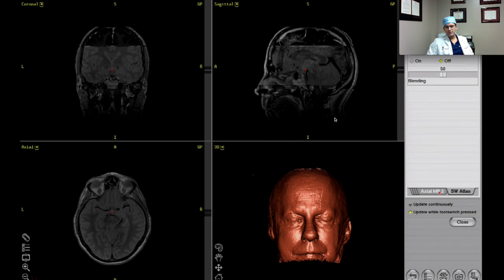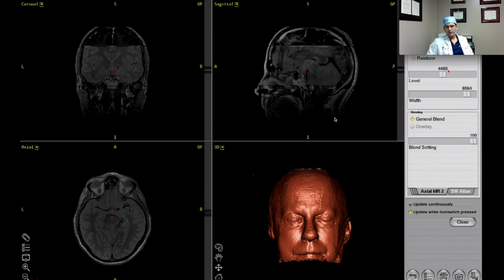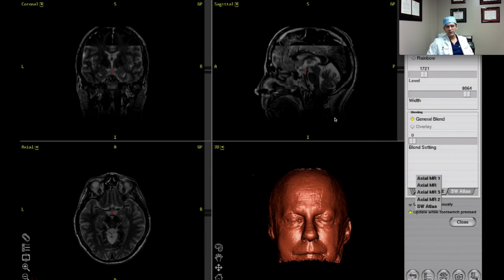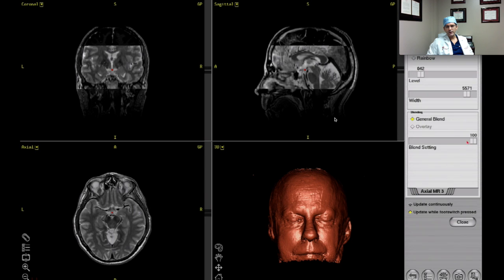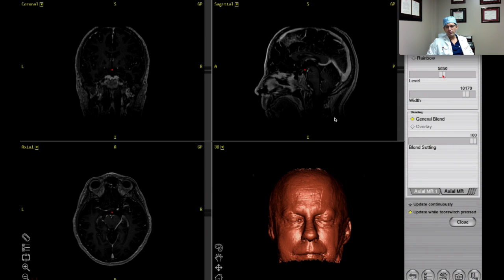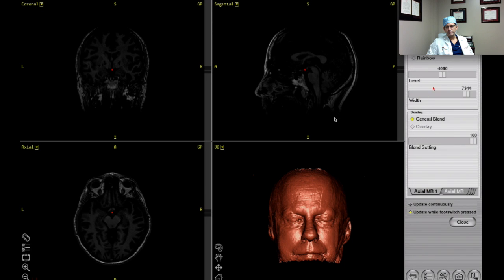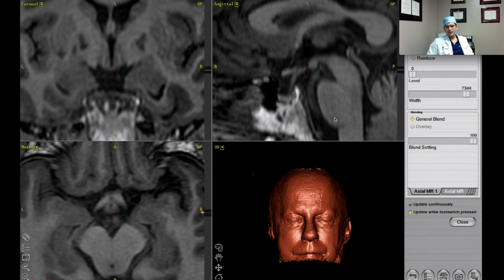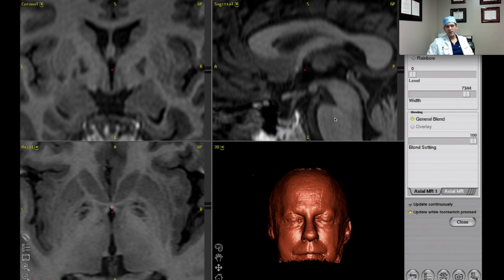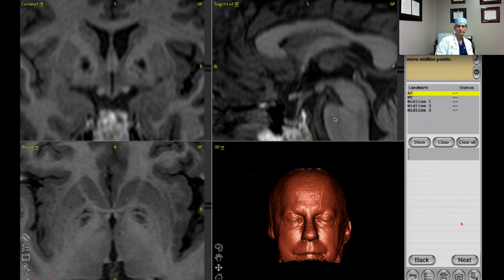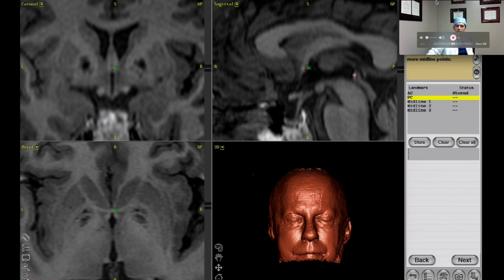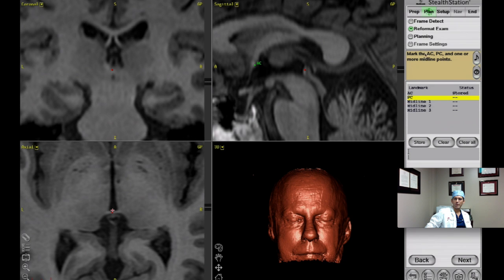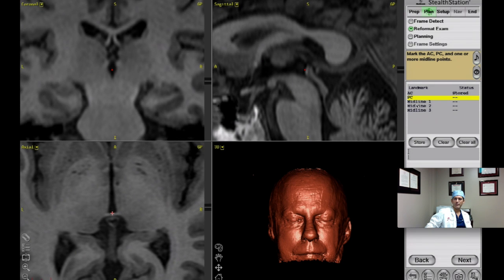During this time, the patient is basically going to sleep with anesthesia and we're placing the frame. This is a surgery done under general anesthesia. I'm windowing — I have four sequences up at this point, and usually the default is a little bit dark so I'm brightening it up. And there's the anterior commissure. I'll move this window so you can see what we're marking — the ACPC points and then three midline points.